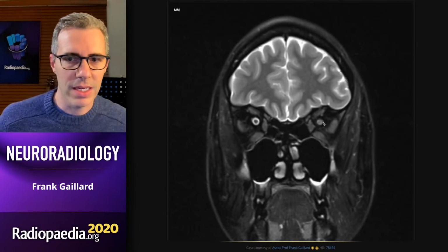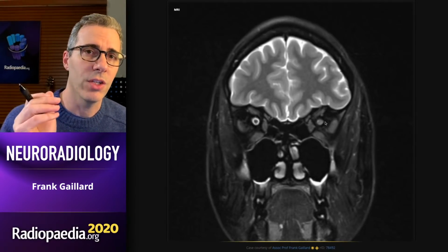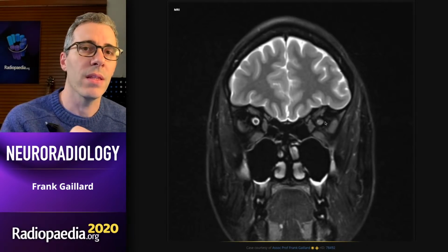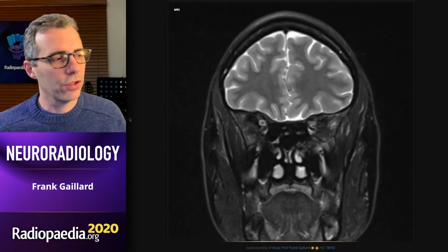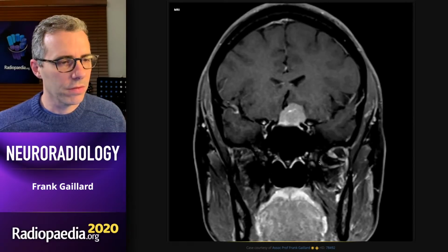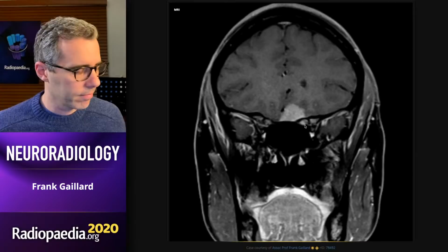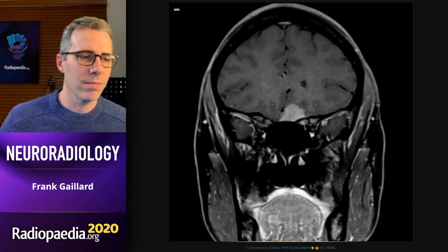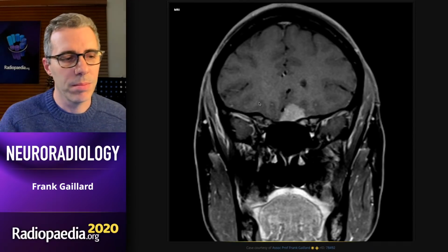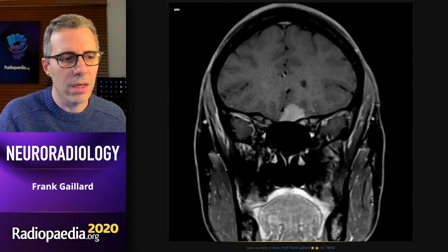The fact that there's no CSF here tells you that there's obstruction to the normal communication between the subarachnoid space and the optic nerve sheath. And it's due to this tiny little amount of tumor in there. Now, in this patient, the surgeons will probably not see that unless they see it on the scan, because intraoperatively, this is not an easy region to get to.